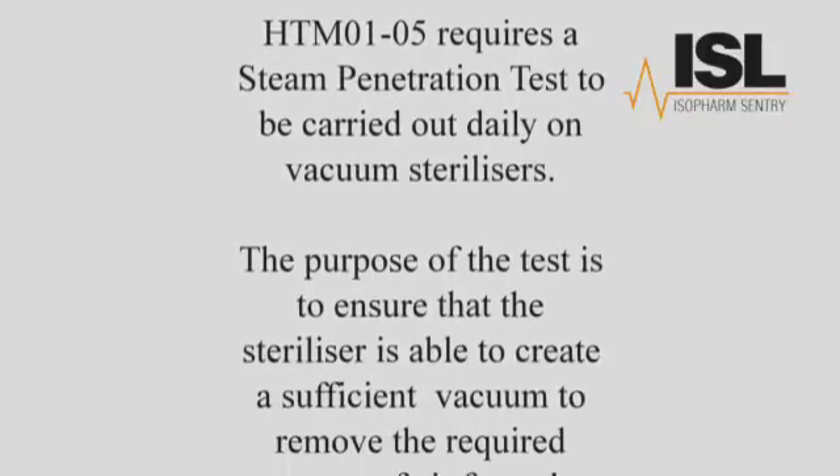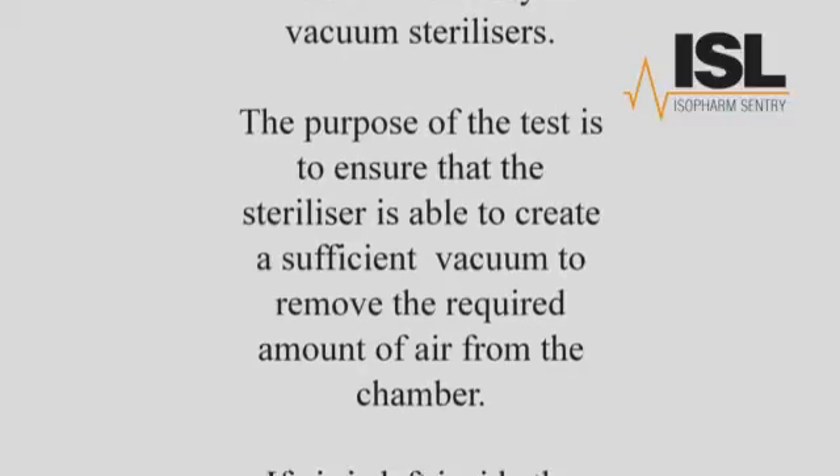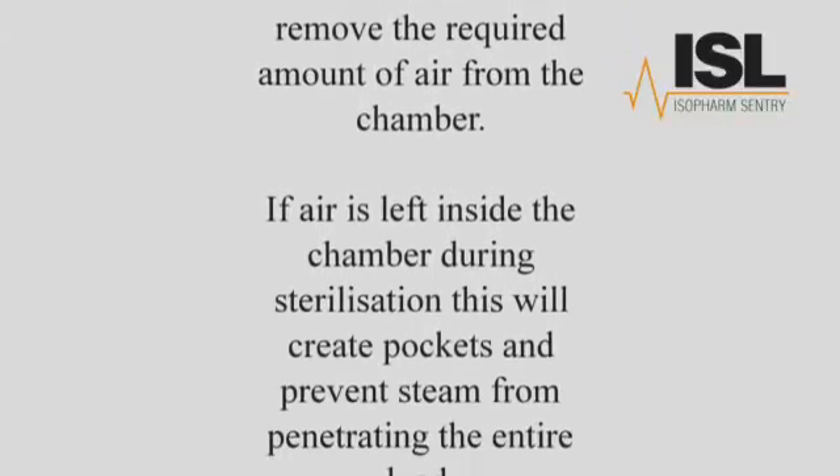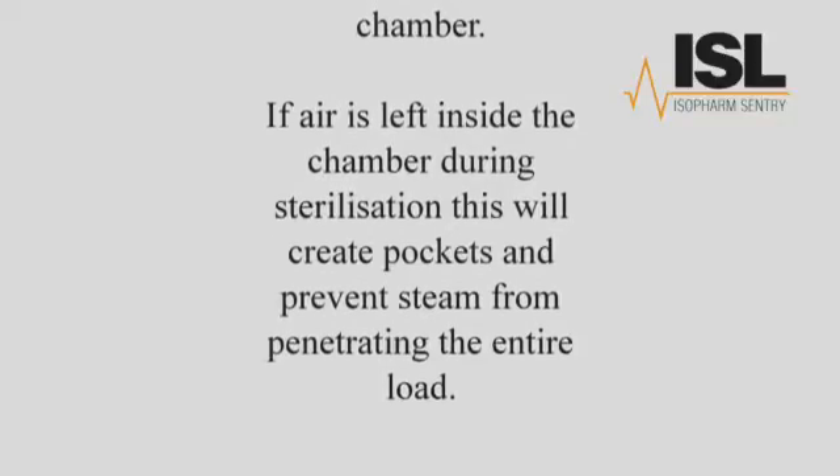The purpose of the test is to ensure that the steriliser is able to create a sufficient vacuum to remove the required amount of air from the chamber. If air is left inside the chamber during sterilisation, this will create pockets and prevent steam from penetrating the entire load.